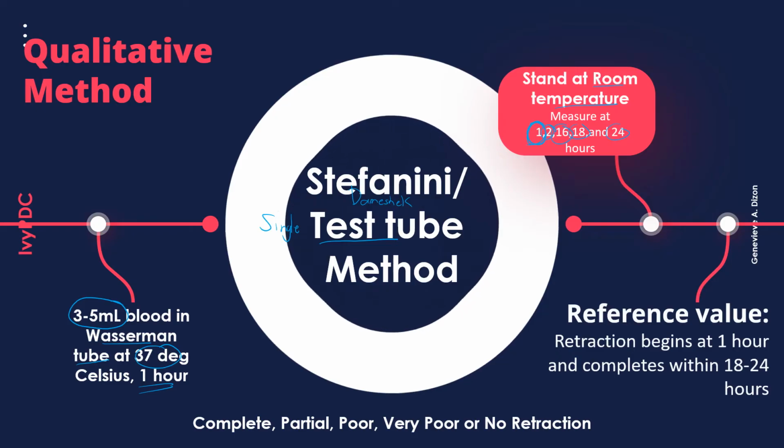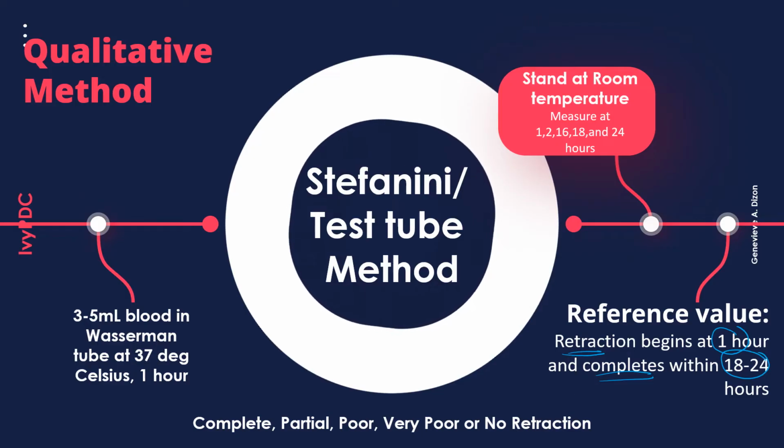The reference value for this test is that the retraction should begin at 1 hour and it should have been completed at 18 to 24 hours. Results for this test may be a complete retraction, partial retraction, poor, very poor, or no retraction.